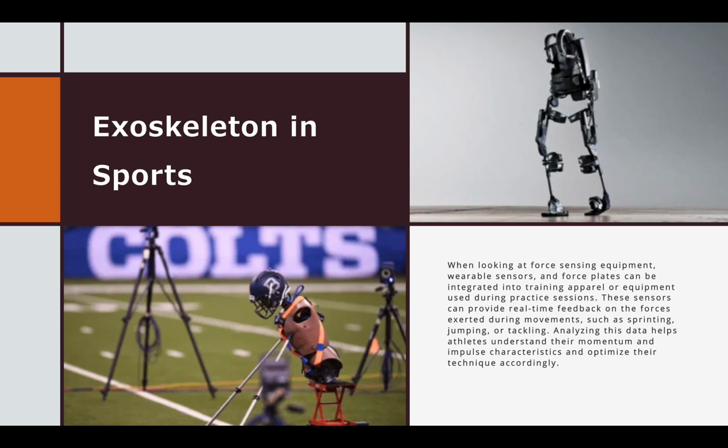Exoskeleton in sports. When looking at force sensing equipment, wearable sensors and force plates can be integrated into training apparel or equipment used during practice sessions. These sensors can provide real-time feedback on the forces exerted during movements such as sprinting, jumping, or tackling. Analyzing this data helps athletes understand their momentum and impulse characteristics and could help optimize their technique accordingly.